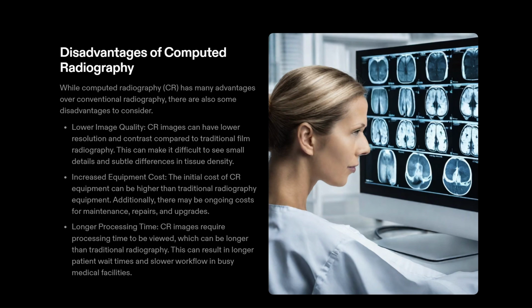While zooming in to see small objects or small details, the image will be blurred and not of good quality. Increased equipment cost. The cost of the computed radiography equipment may be higher than traditional radiography. Additionally, there may be extra costs for maintenance and repairs, which makes it more expensive.